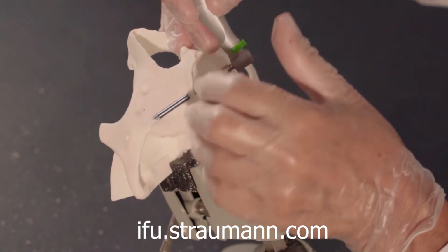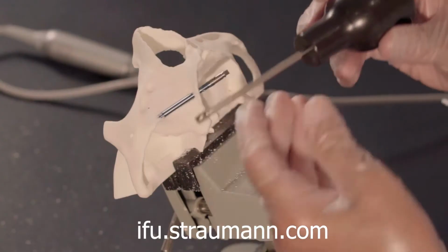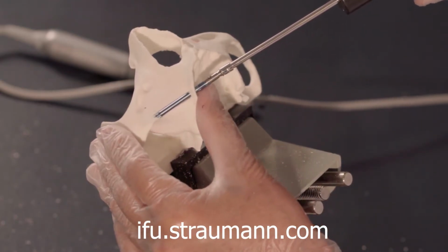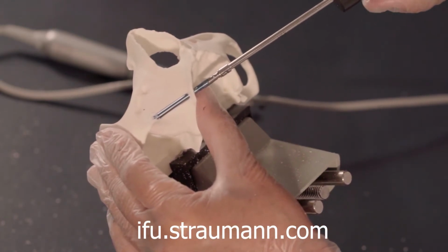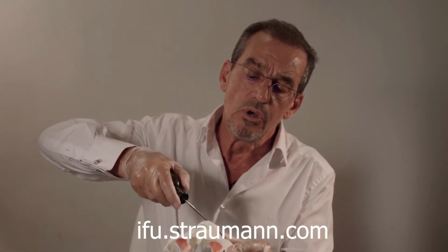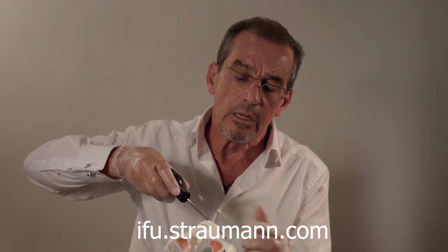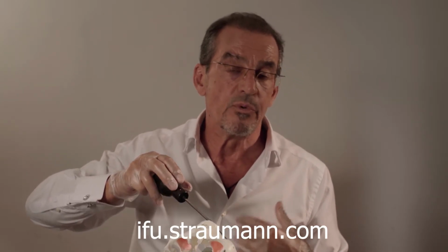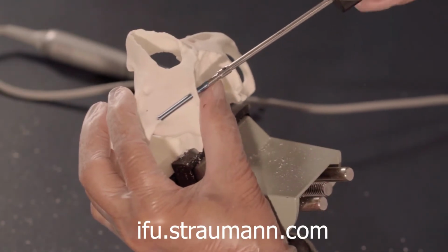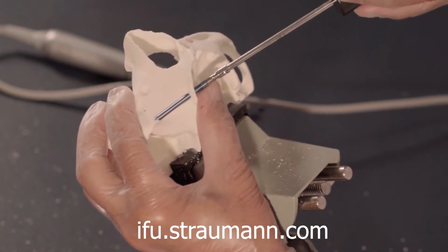So now I'm going to use the hand wrench in order to complete the implant insertion. One thing you should pay attention to is the degree of resistance you get, because this implant design will provide you with a lot of implant stability. So you may go forward, or sometimes you may go a little bit back and then forward.